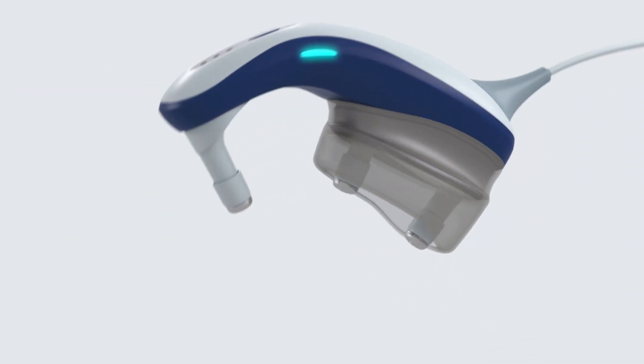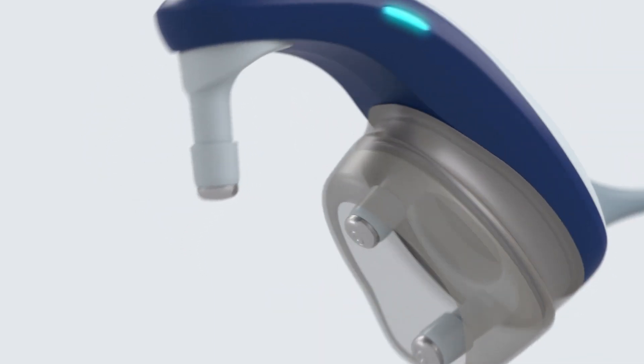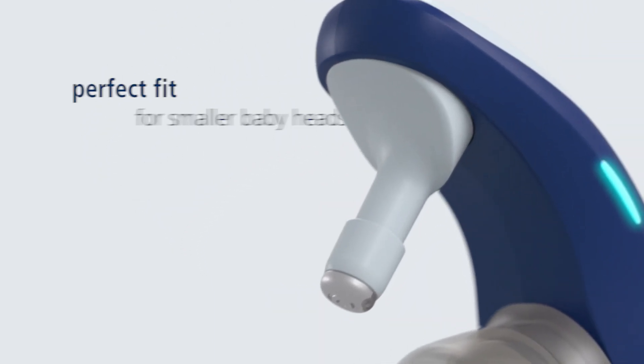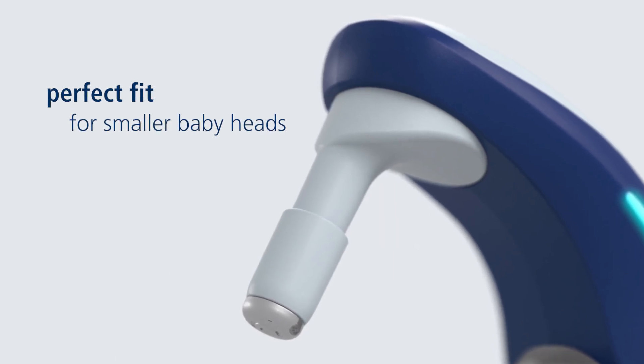The stainless steel electrodes are spring-loaded and adapt gently to the baby's head. The forehead electrode can be rotated or replaced with an optional longer electrode for very small baby heads.